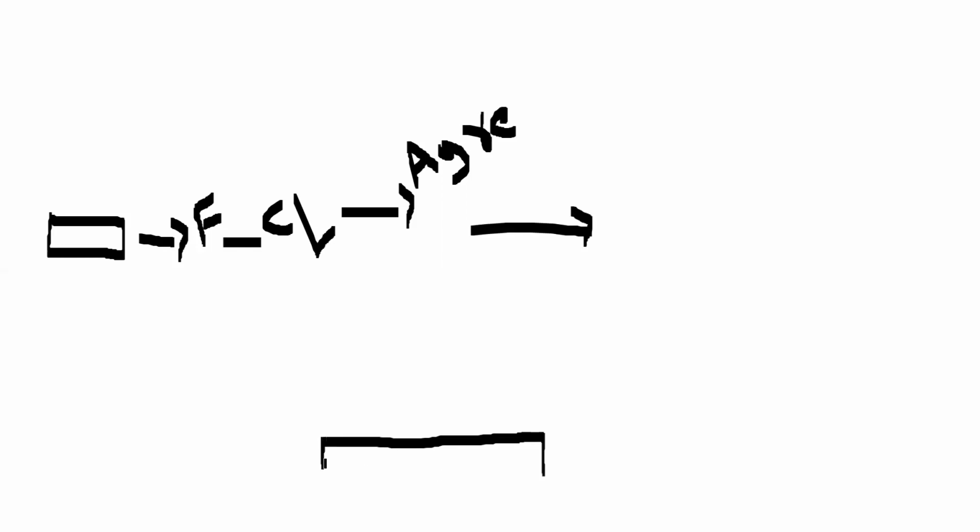See here. First we got a tissue, and the tissue has been fixed. It is subjected to fixation. Fixation caused a problem: it formed cross-links. Now these cross-links have been removed by antigen retrieval, right? Now I will show you here what happens in the tissue. So this is the tissue. Then we did antigen retrieval so that the masked epitopes have been unmasked in the tissue.